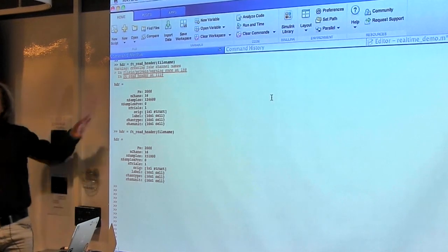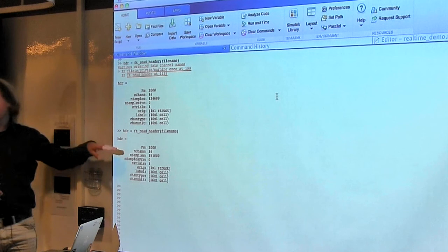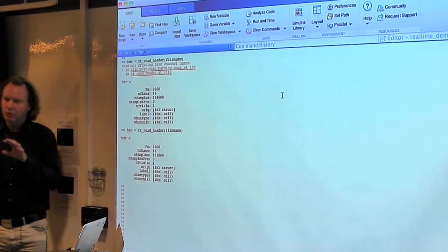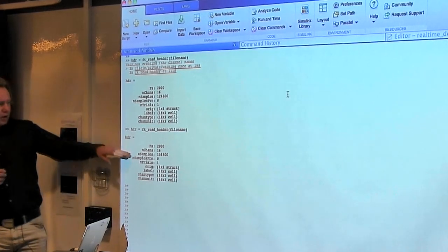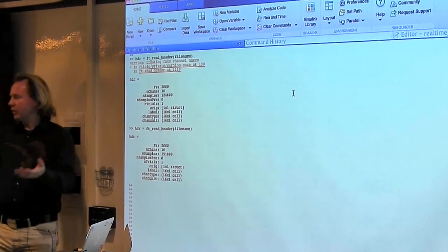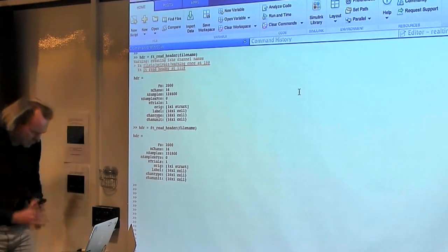I'm abstracting away that it's a ring buffer, so not all of those samples might be accessible anymore. In general, you should count on about 5 minutes of data being in a ring buffer. But you can think about it as a constantly growing file on disk, except that you can access this one much faster, in memory.